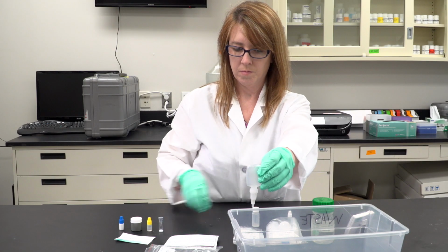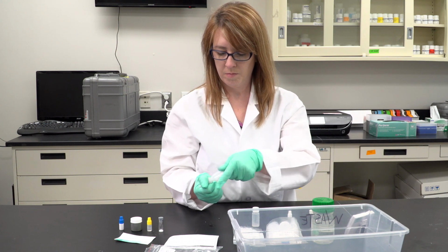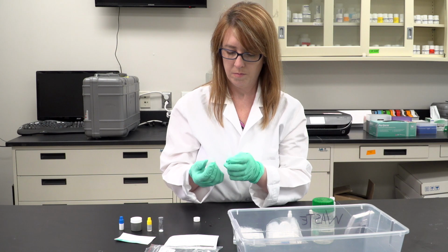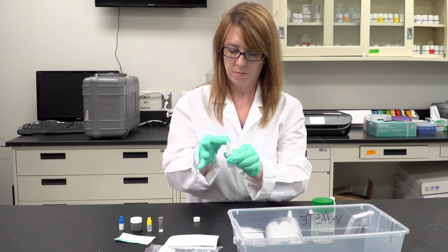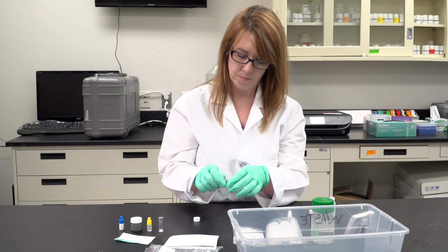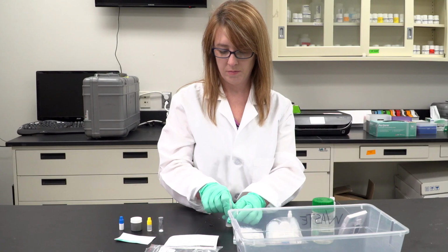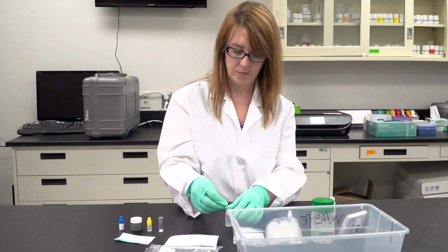Remove the filter cap and attach to lysing reagent bottle. Flick the bottle to dislodge the filter cake and turn bottle upright to allow filter cake to fall into lysing reagent. Mix well but avoid foaming. Allow 2-minute incubation. During incubation, remove filter cap and discard. Snap the small final filter onto lysing bottle.